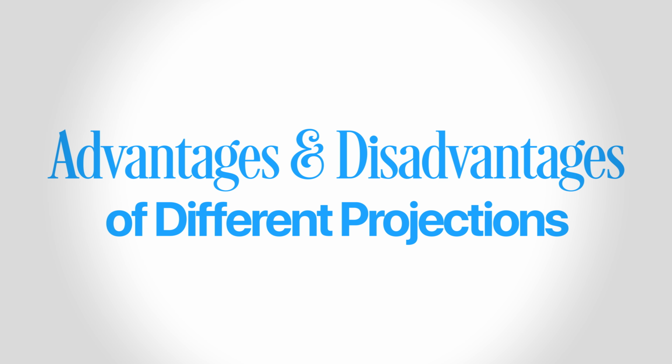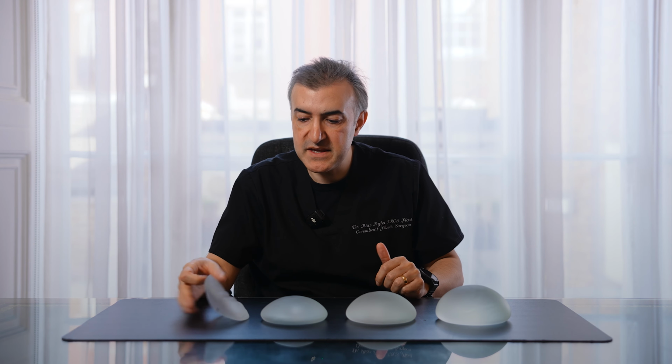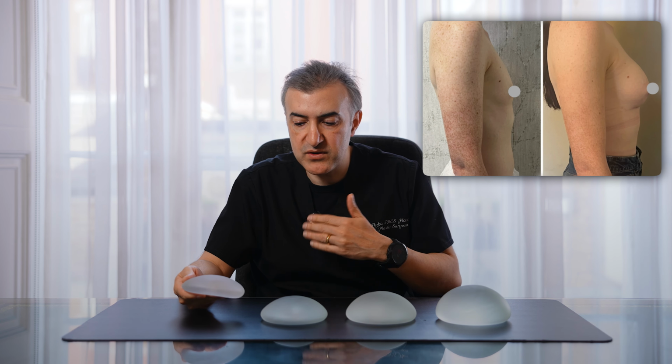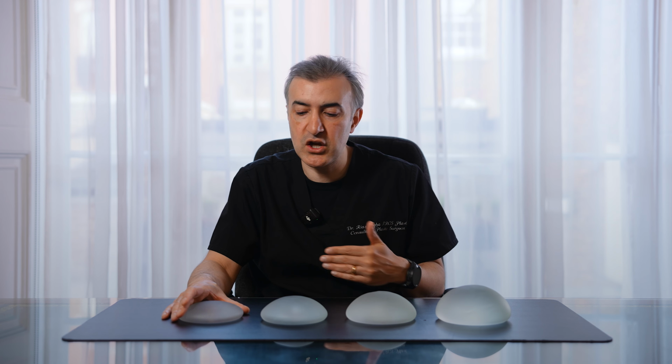So what are the advantages or disadvantages of different projections? Well, you want to get the right kind of volume for what you want. So if you are a C cup and you want to be a double D, then this probably won't take you there because it's just not enough volume. So a low projection would be good for somebody who just wants to add a small amount of volume. They just want a little bit of extra fullness at the upper pole. They're not looking for much, and that's who that would be appropriate for.